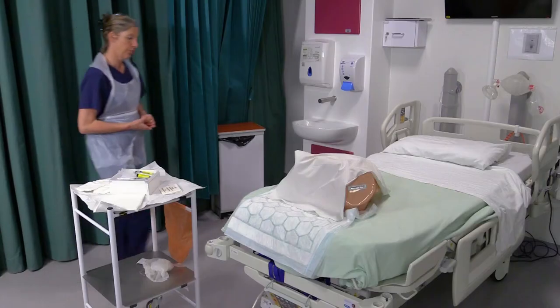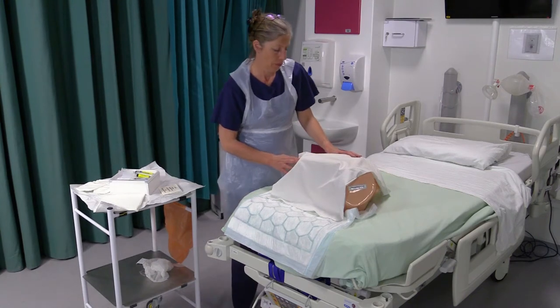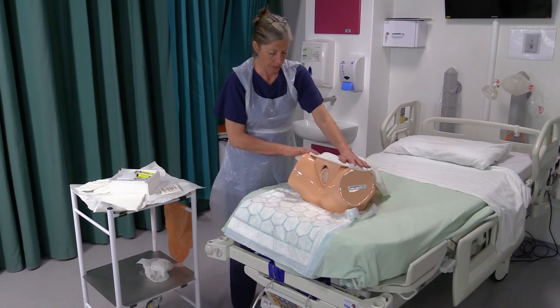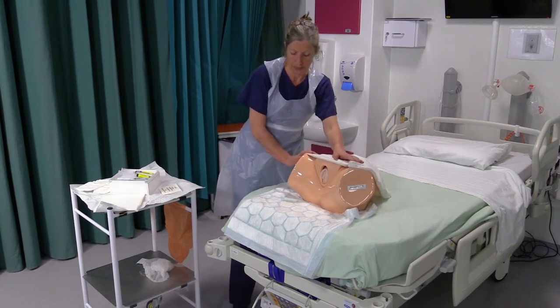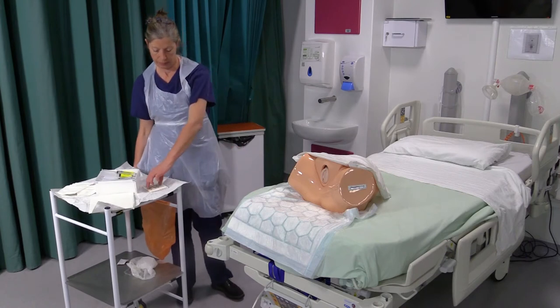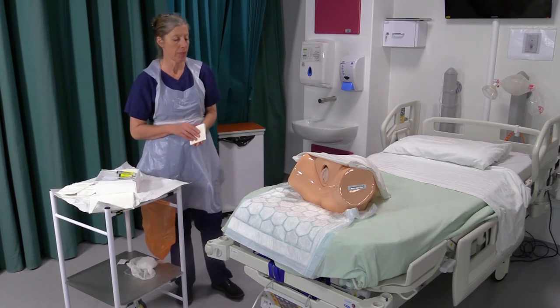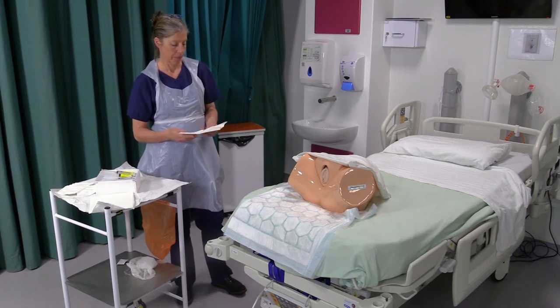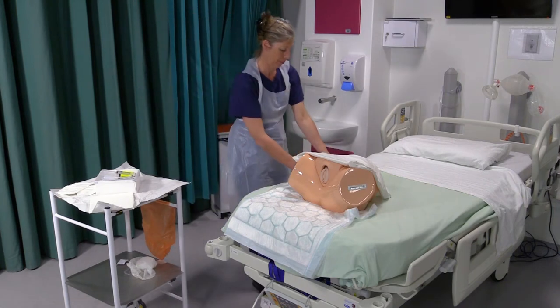Prepare your patient for the procedure. Get them into the preferred position, which will be flat on their back. Bring their knees up, heels together, and relax the legs out to the sides. Alternatively, if your patient is obese or they have problems with their joints, they can roll onto their side and lift their leg up slightly.